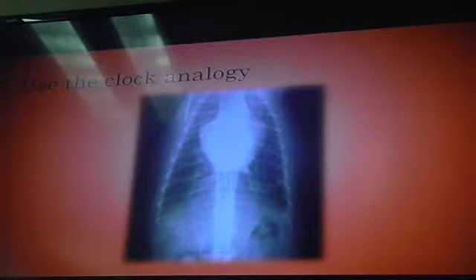On 5, that opacity right there, is it the cardio... Come show me on the other TV. Whichever one. Well, I think it is, but I can't see it. I think it's just exposure. So this film was really light and I had to play with it. So what you're seeing in this region are your caudal vessels. You're seeing the costochondral junctions kind of coming in right here. Everybody see that? That's what she's pointing to in this region. So you have some vessels that kind of live in this area. Then you have these costochondral junctions, which is mineralized, and so it makes it seem really bright. And then this image, I had to kind of play with in order to put in this PowerPoint. Answer your question? Okay.